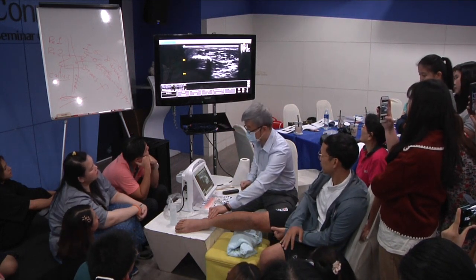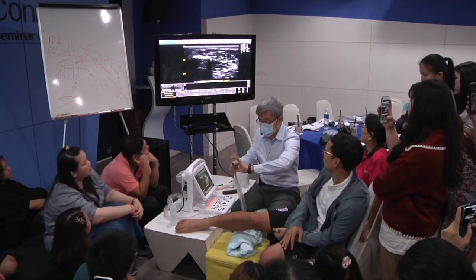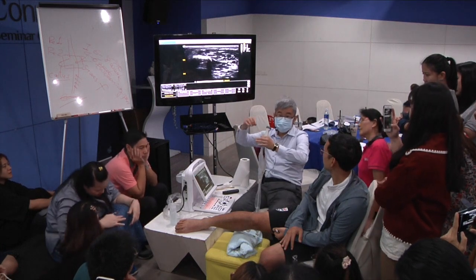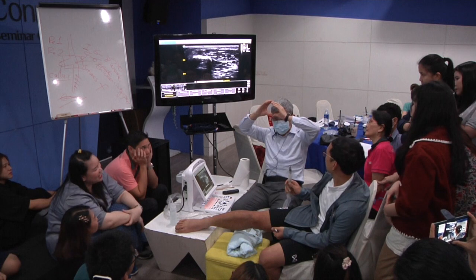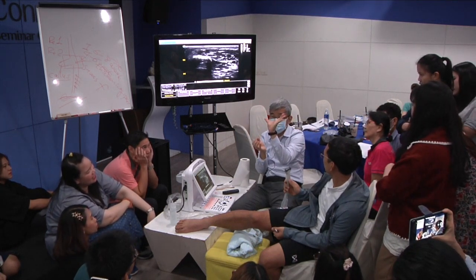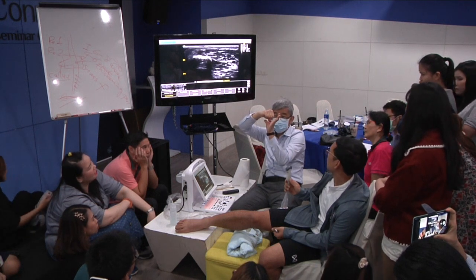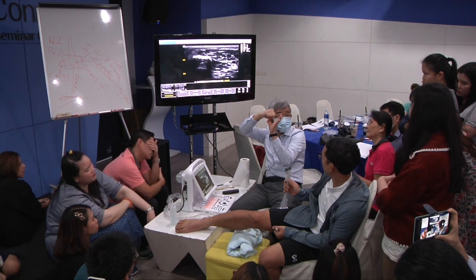Okay? And the longus is ovary shaped. Can you hold that for me? The ovary shape. The brevis is like a new moon. Hold. Okay, hold the longus.